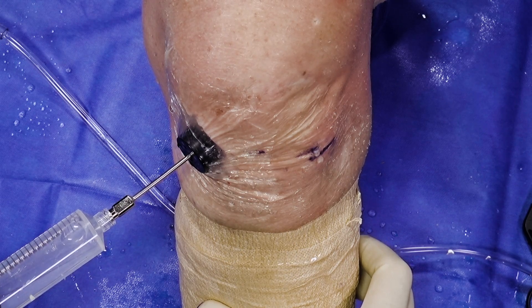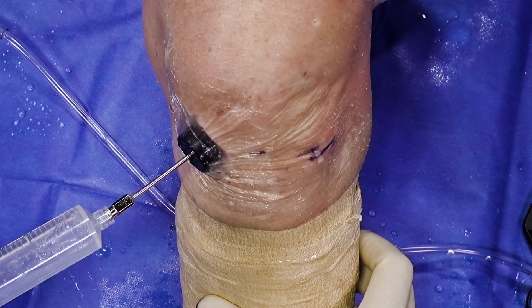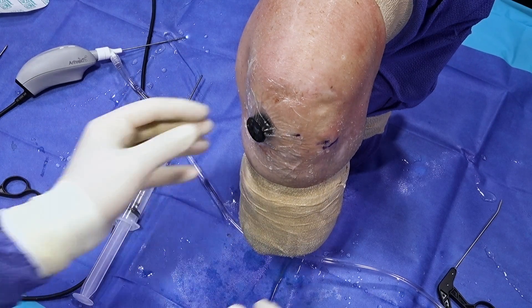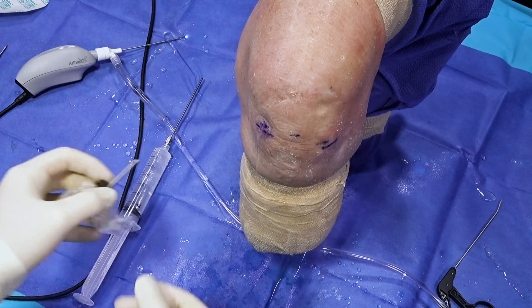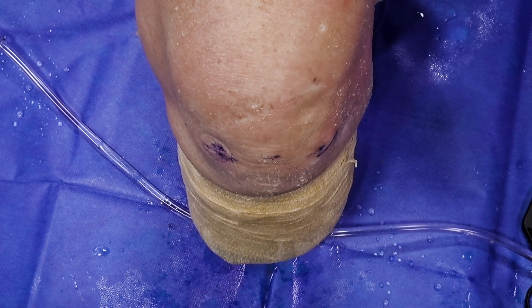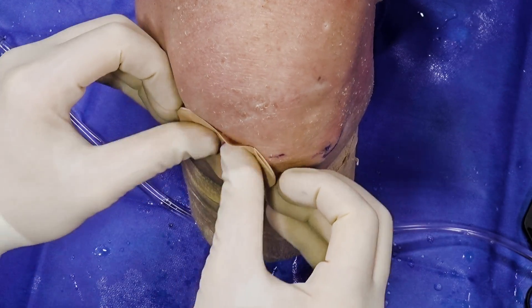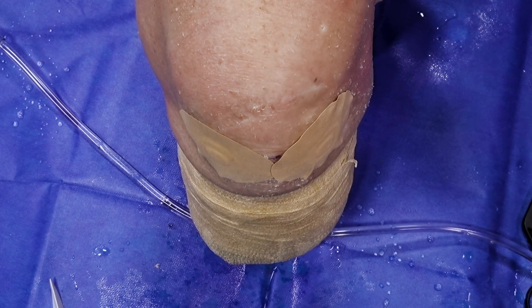Prior to finishing the procedure, I will always aspirate any remaining fluid within the joint, as it really helps with the patient's discomfort. After the fluids are removed, we can take down the Tegaderm and remove the cannula. After the procedure, we don't have any incisions to close with suture. We will apply Jumpstart bandages to protect the portal sites and help reduce the risk of infection. The patient is then transferred to the recovery room where their stay is minimal compared to traditional methods, as we have minimized or eliminated the use of general anesthesia. It allows us to initiate physiotherapy very quickly after surgery and really hasten the patient's recovery process.